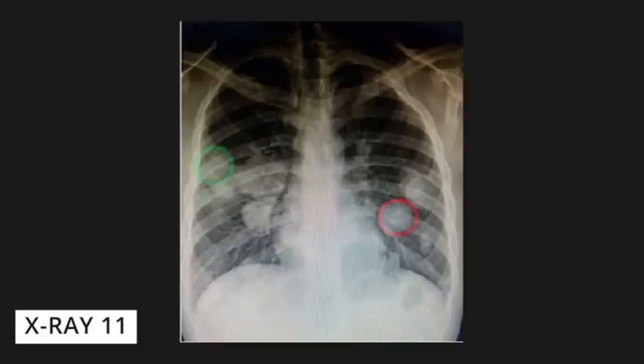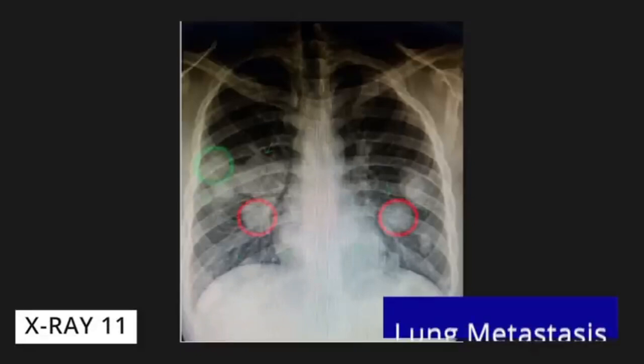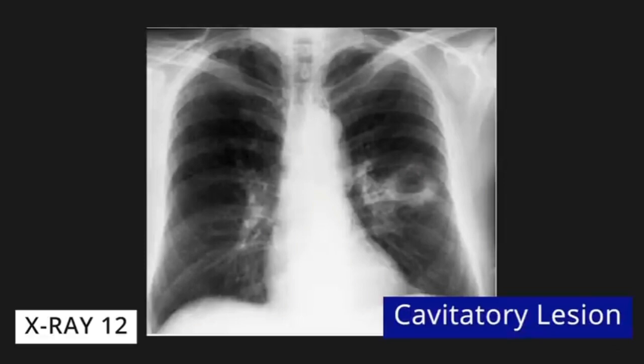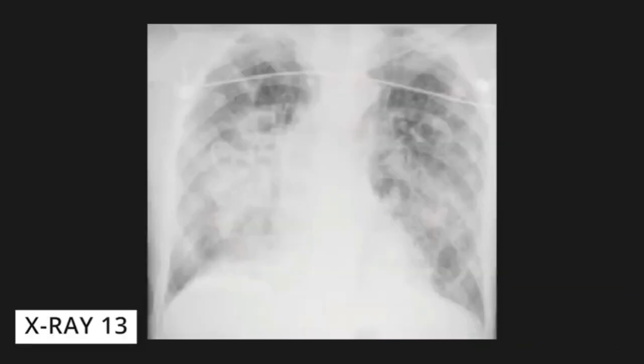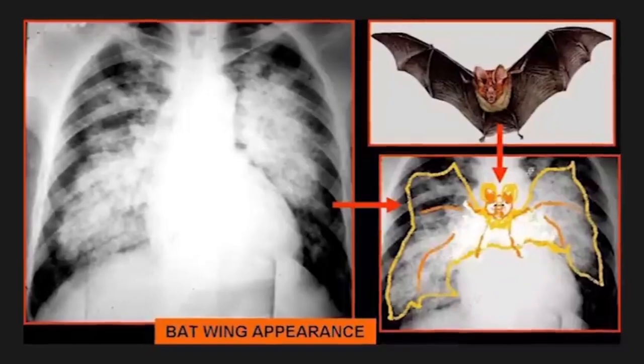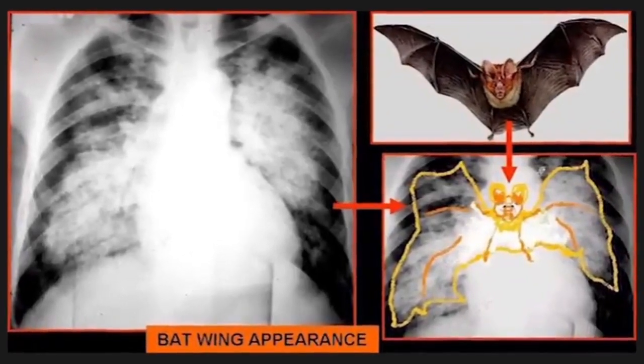Exactly. C is cardiac. We mentioned the size illusion earlier, but is there a hard rule for when the heart is actually too big? The 50% rule. On a standard PA film, the heart width shouldn't be more than half the width of the chest. And if it is, you worry about heart failure. Yes. Moving to D for diaphragm. This sounded like the scariest red flag in the entire lecture.